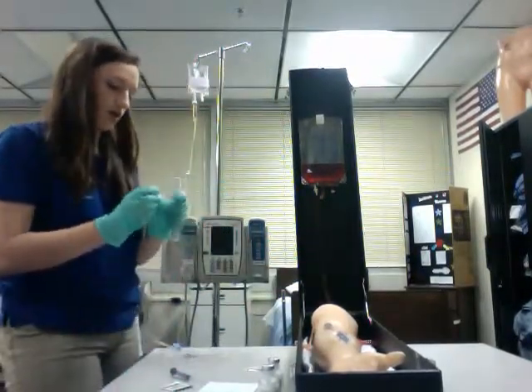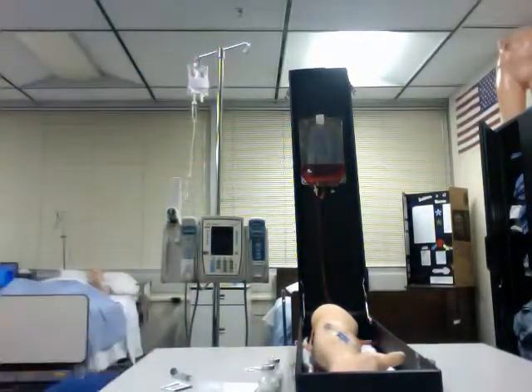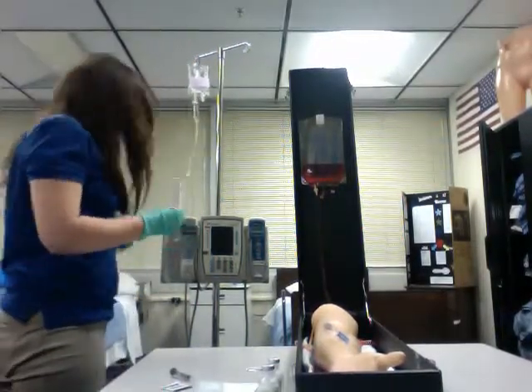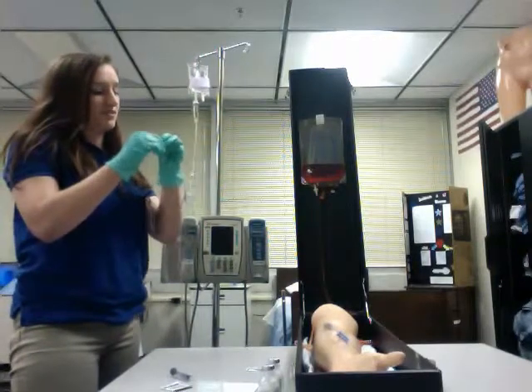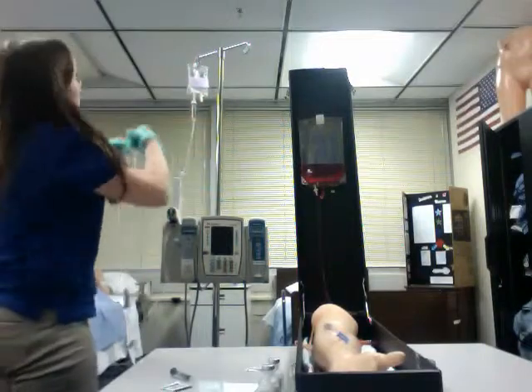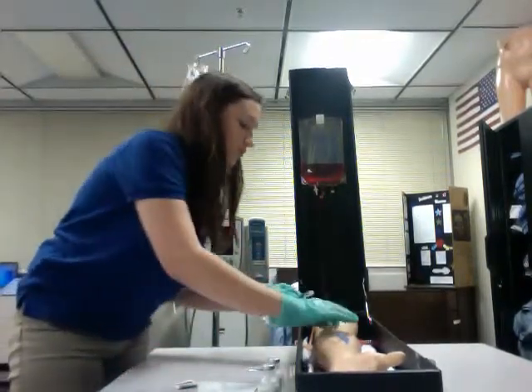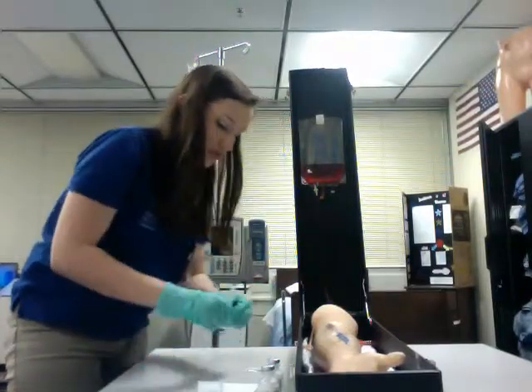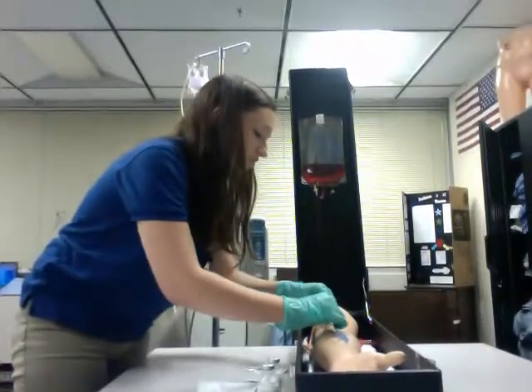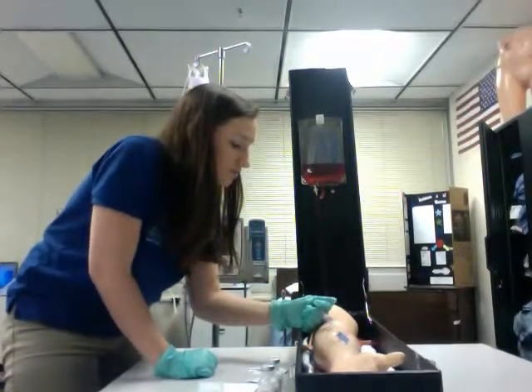and put the alligator clamp on, which I did not just drop that. Okay, I didn't drop it. And now I'm going to put that on my tubing. That way it's ready for the next administration of medication. Hang this up here. And one more time, I'm going to flush the saline. Flush with saline. Clean it off. And flush the last 3 milliliters.